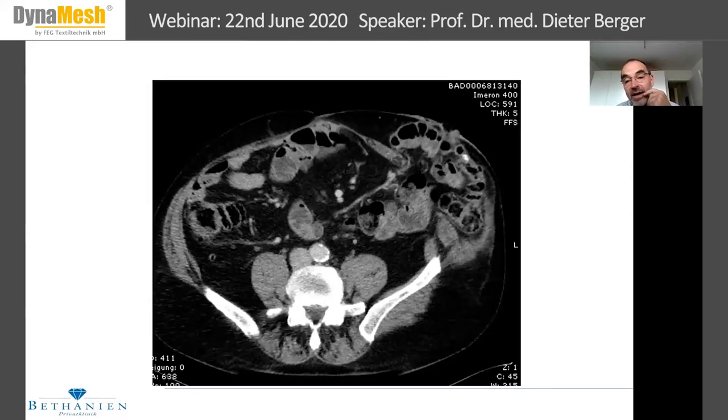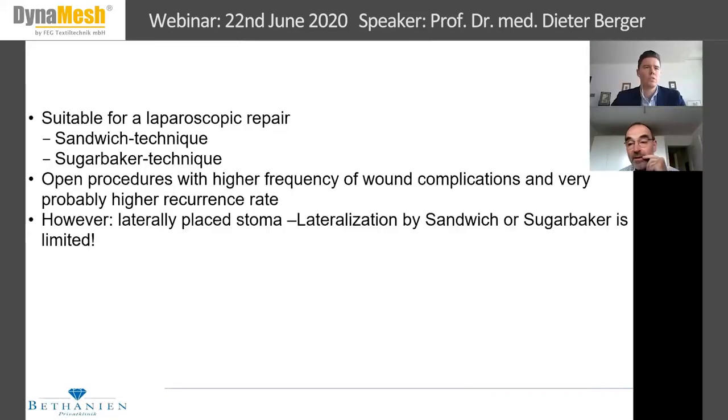And therefore I present this patient. It may be possible as well, not it may be possible, it is absolutely possible as well, and it's also a good idea to stabilize the abdominal wall right here and to do a relocation with a prophylactic mesh, but always, of course, with a prophylactic mesh in the right lower quadrant. There's a question on this study, I believe.